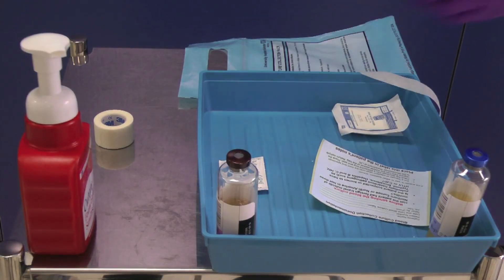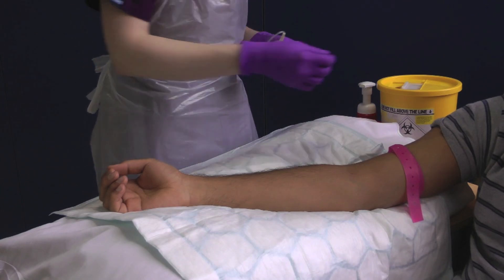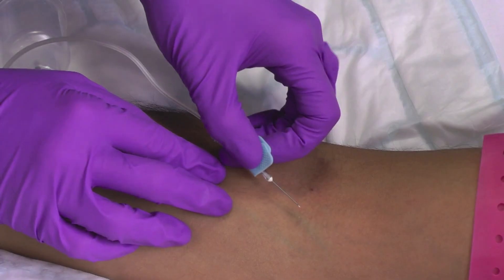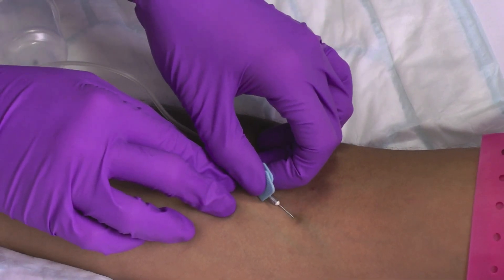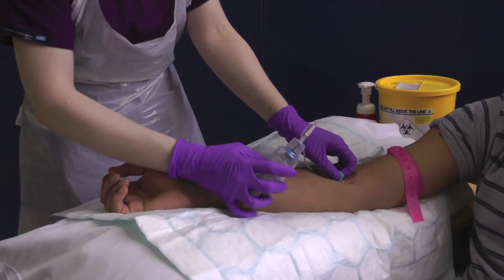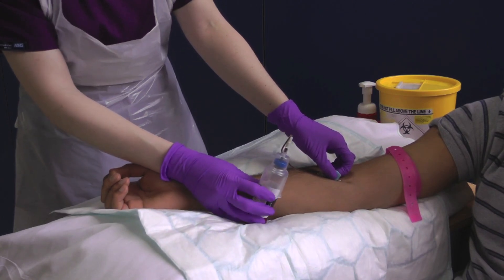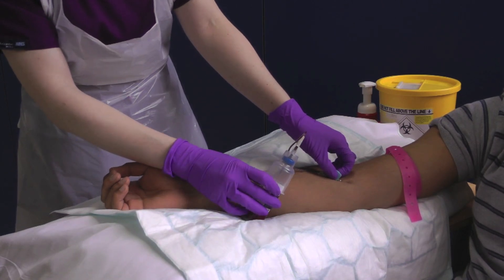Take your collection set and remove the plastic sheath from the winged needle. Apply traction below and to the side of the proposed puncture site to help immobilise the vein. Advance the needle bevel up into the vein. Once the needle has punctured the vein, you can release the traction on the patient's arm. Whilst immobilising the needle with one hand, take the aerobic blood culture bottle and pierce the septum using the adapter cap. It is important to fill the aerobic bottle first as there will be air within the collection set. Hold the bottle upright and collect 10 millilitres of blood.